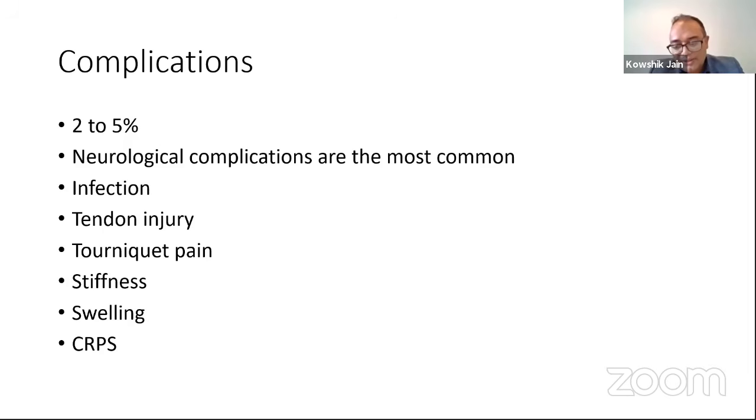Knowing the anatomy, knowing where the structures are, and diligently marking them out before starting the procedure can all minimize this undesirable, totally unnecessary complication. Infection very rarely happens. It's less than a 1 in 100 chance of infection, but it can happen after any procedure.